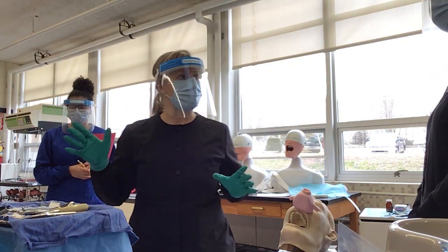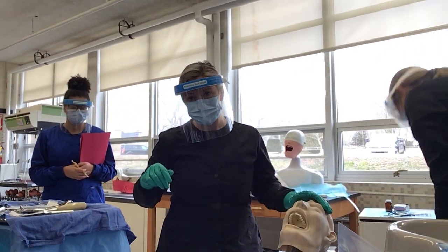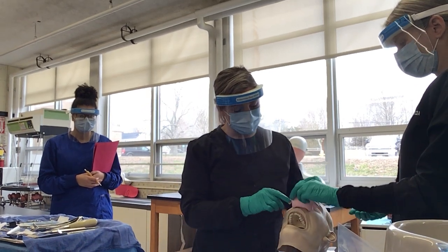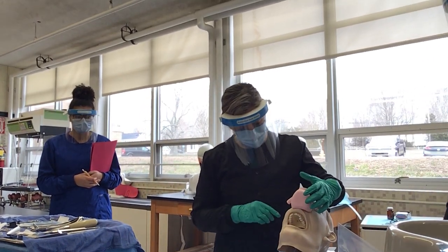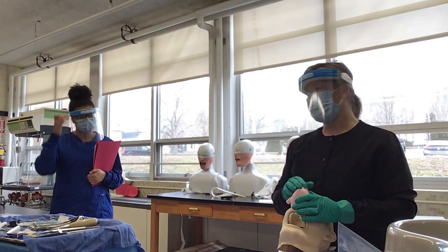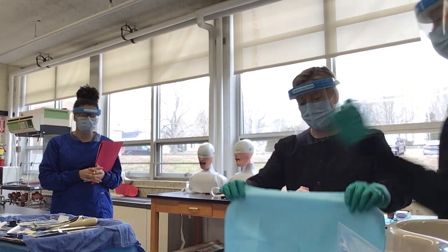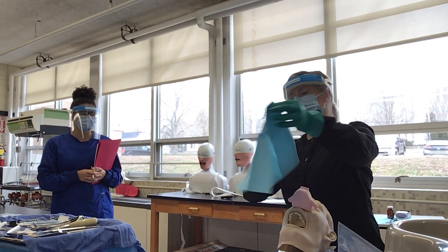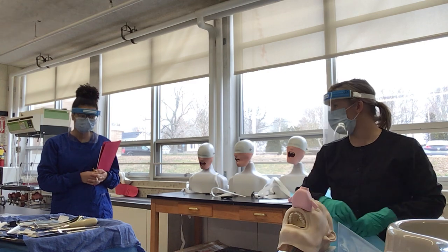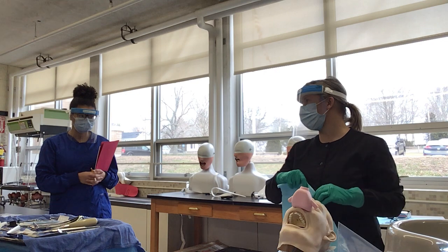So, we are going to be extracting tooth number 14. So, patient's pre-op vital signs were taken. He's now going to have 100% oxygen on his nose. They will sometimes use nitrous oxide also. We'll talk about that in dental science. The oxygen tank is here. Oxygen tank is always green, so he's getting 100% oxygen. If he was to get nitrous, the nitrous oxide tank is always blue.